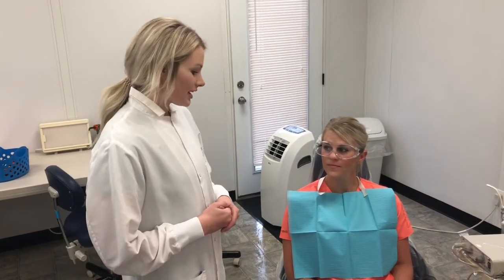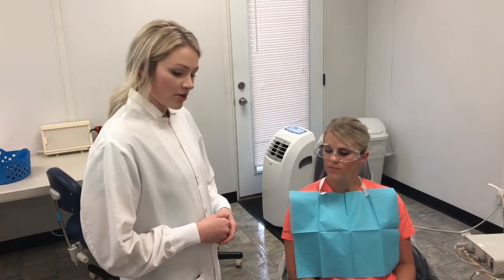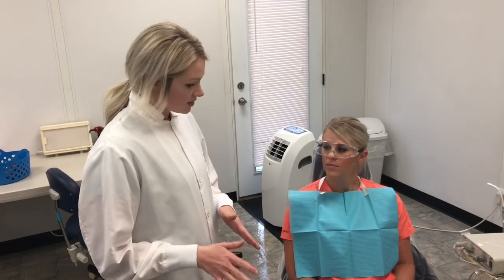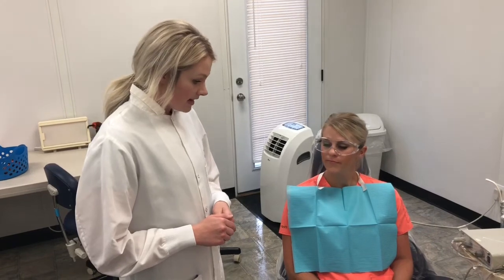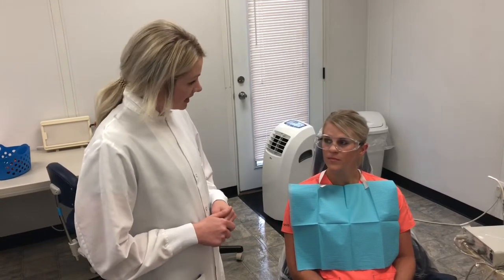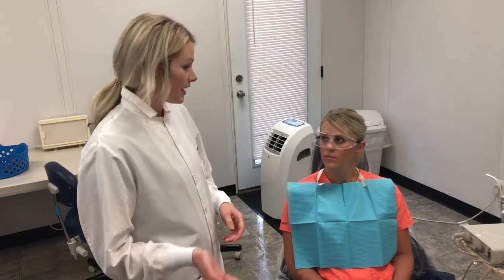Ms. Reif, we are going to apply a neutral sodium fluoride for you today because you do have some composite restorations. This will help to decrease the white spots on your teeth. You do have a little higher risk of decay, so this will help to prevent decay for you. It will also help to decrease your cold sensitivity and it does help to remineralize your enamel. It's going to sit in there for four minutes — I'm just going to dry off your teeth, let it sit in there, and then we'll go ahead and remove it.